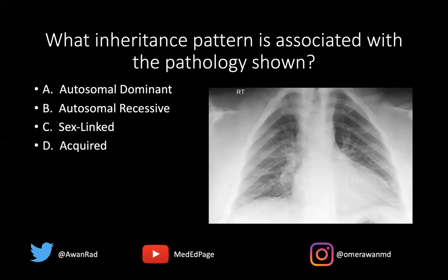The first thing we should do when looking at a chest X-ray — and I know this is an MSK case — is always great to look at the lungs. This is the right lung, this is the left lung. We can see some increased vascular markings throughout the lungs, particularly centrally. That's not the purpose of the case. We want to look at the heart and the cardiomediastinal borders. There's no widening of the mediastinum, the trachea is midline, we can see the heart borders very well, no evidence of pneumonia, and probably not cardiomegaly or upper limits of normal heart.